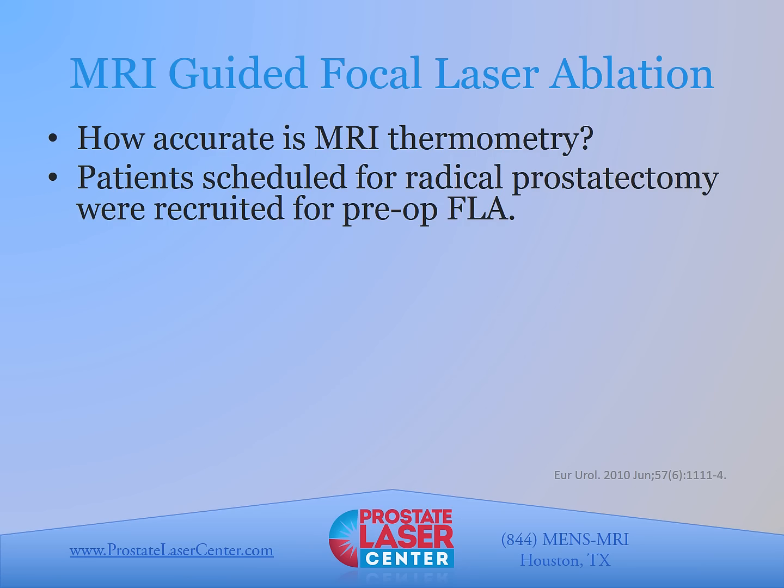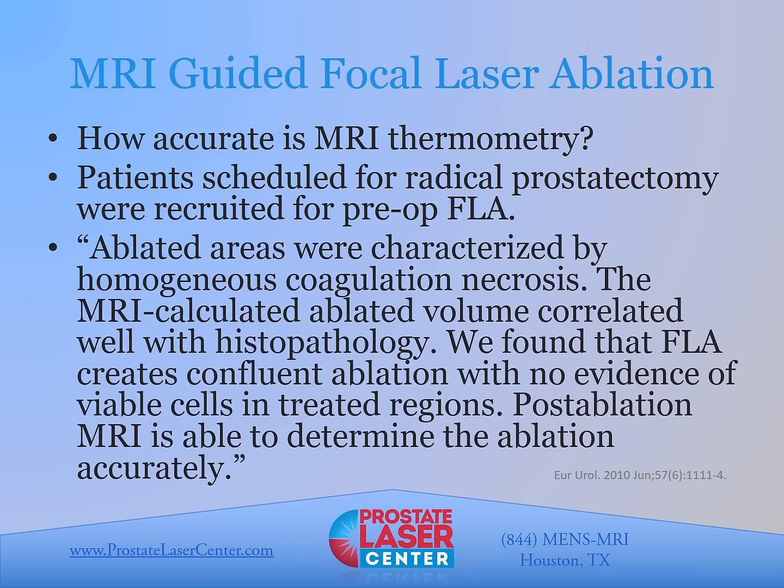So how accurate is MRI thermometry? Well, there was an interesting study where patients were scheduled for radical prostatectomy. They were already going to have the surgery, and they were recruited for a preoperative focal laser ablation. And this is what the study demonstrated. Ablated areas were characterized by homogeneous coagulation necrosis. The MRI calculated ablated volume correlated well with histopathology. We found that FLA creates confluent ablation, with no evidence of viable cells in targeted regions. Post-ablation MRI is able to determine the ablation accurately.